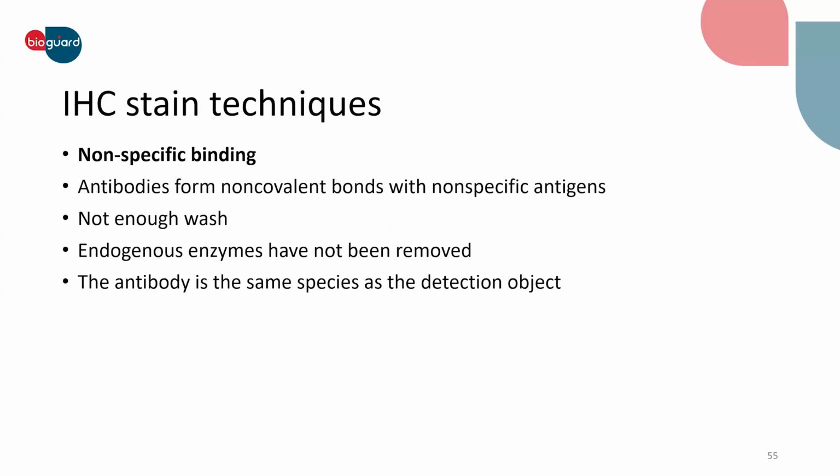And here are some non-specific binding factors. They include antibodies forming non-covalent bonds with non-specific antigens, not enough washing, endogenous enzymes that have not been removed, and the antibody being the same species as the detection object.